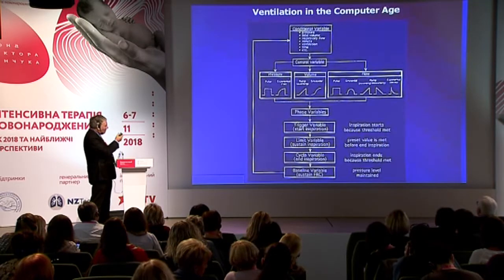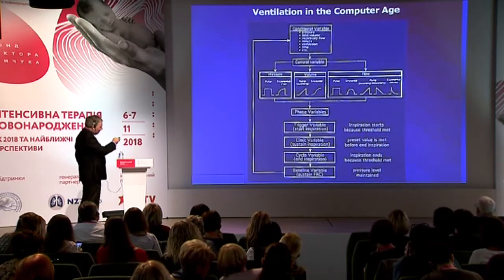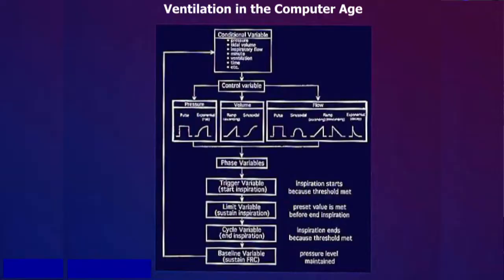And here's an example, and I'm not going to walk you through this very complicated diagram, but what I do want to point out is just this middle panel, and you can see that we now have the ability to independently manipulate the way we deliver pressure, the way we deliver flow, and importantly, the way volume is delivered to our small patients.